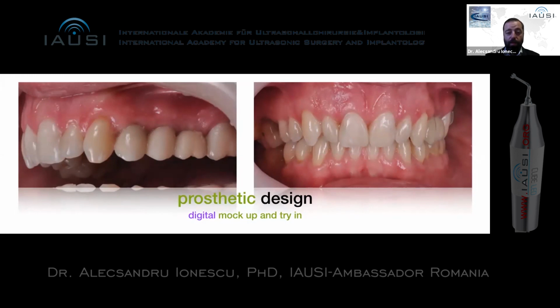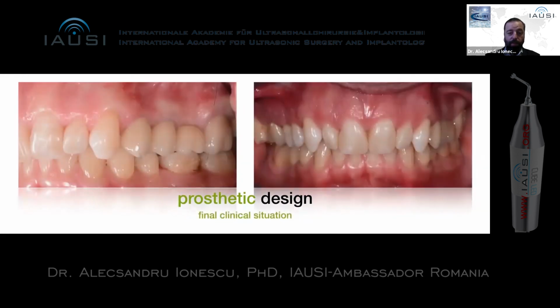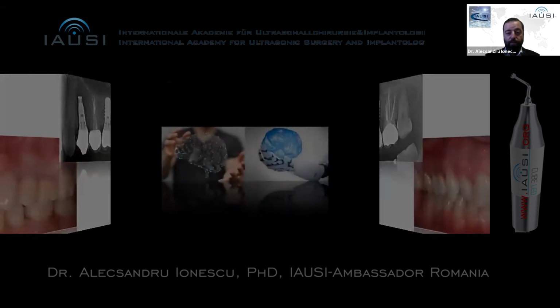We printed the first version of the crowns, and then we milled the final version of the crown. We have some ceramic that was put on the buccal part to mimic the aesthetics better. And this is the final clinical situation. And here is the X-ray after we screw retained the crown for this case.